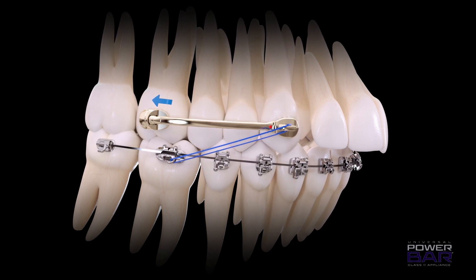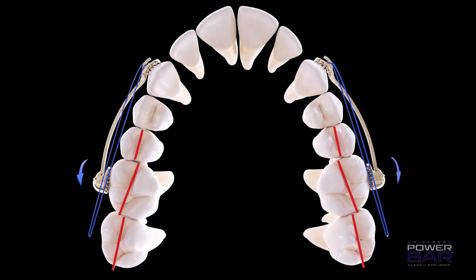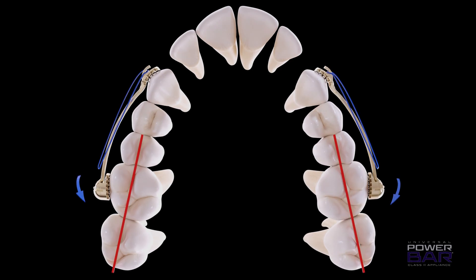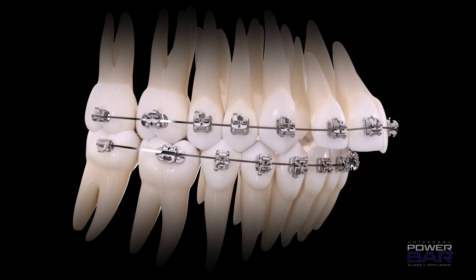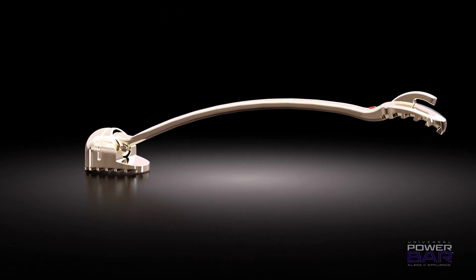With a consistent elastic regimen by the patient, the Power Bar is an early and efficient way to correct Class II and reduce treatment time. The free-moving bar and socket gives you rotational control of molars during treatment, as well as opening space between laterals and cuspids, or cuspids and premolars. Once Class II is corrected, the Power Bar is removed and the space closed with traditional braces. Talk to your AO sales rep and see how this appliance can be incorporated into your practice.